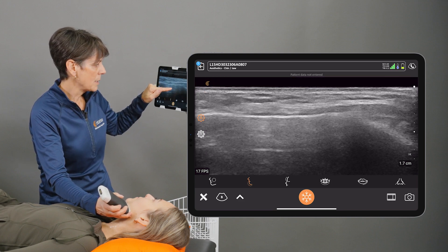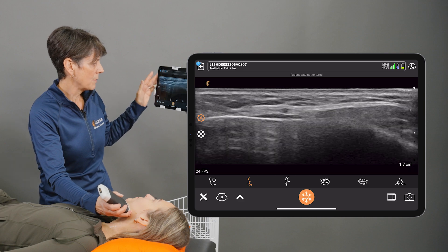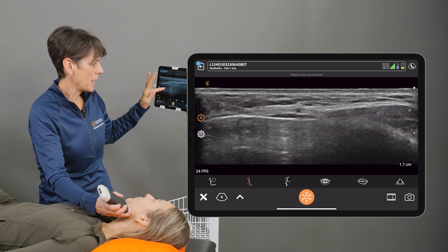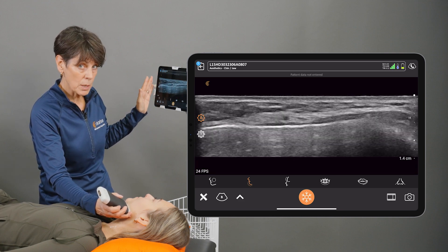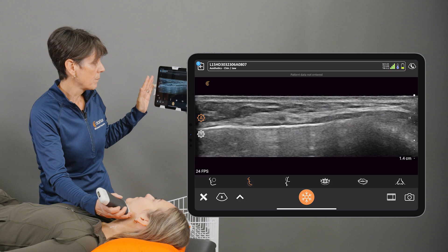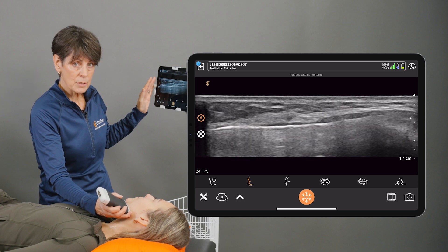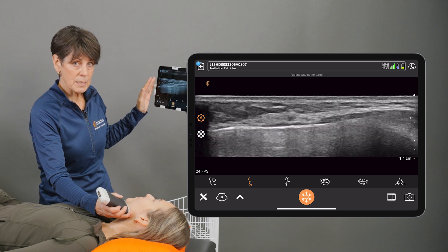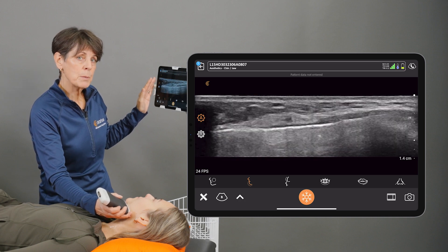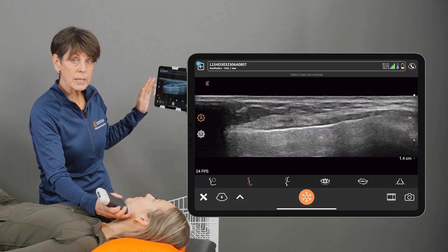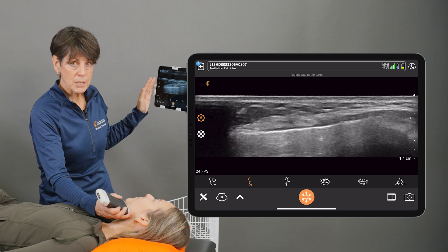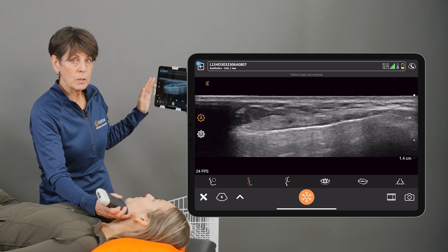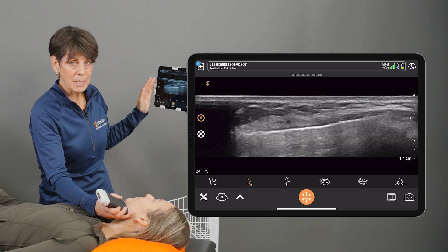So get into the habit of adjusting your depth to optimize the region of interest and have it centered on your screen. That'll be best for learning anatomy, for doing procedures, or treating complications.